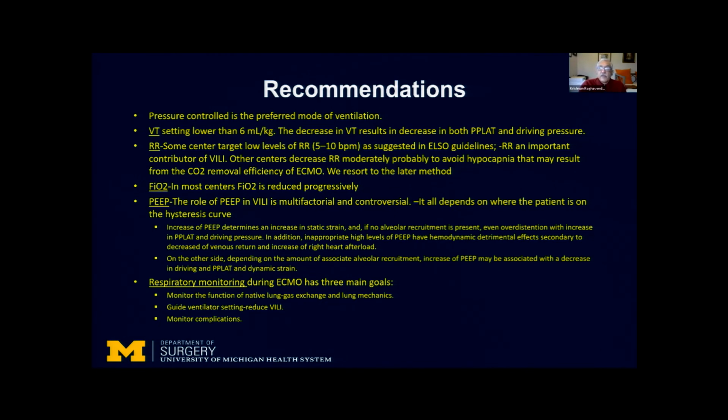And if we get a tidal volume between 4 and 5 ml per kg body weight, as long as the pressures are not high, we feel very comfortable doing that. In terms of respiratory rate, the ELSO guidelines in the past have suggested a rate of 5 to 10. And the logic there is the respiratory rate with the cyclical trauma to the alveoli is also a contributor of ventilator-induced lung injury.